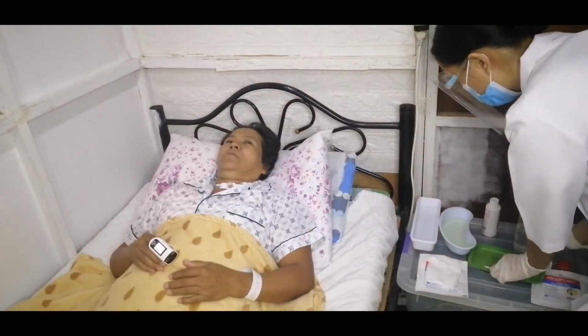Dip cotton tip applicator or gauze sponge in cup or basin with sterile saline and clean stoma under faceplate. Use each applicator or sponge only once, moving from stoma side outward. Pat skin gently with dry 4x4 gauze sponge.